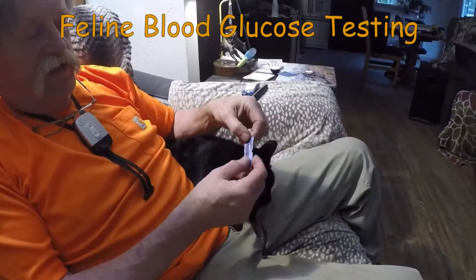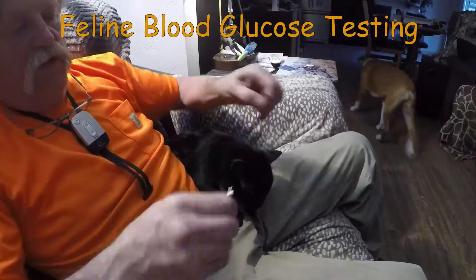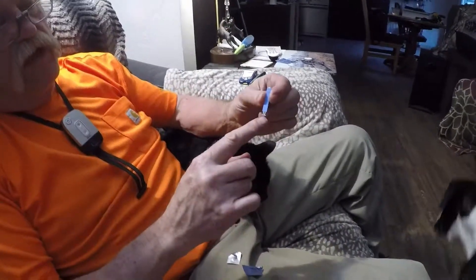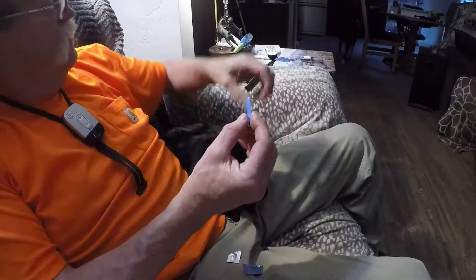This is the reagent strip to test the blood sugar. Take it out — there's the electronic end that goes in the machine. This is the area that you get the blood in.